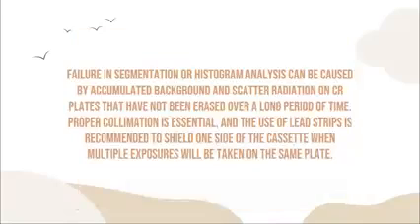Failure in segmentation or histogram analysis can be caused by accumulated background and scatter radiation on CR plates that have not been erased over a long period of time. Proper collimation is essential, and the use of lead strips is recommended to shield one side of the cassette when multiple exposures will be taken on the same plate. Okay, so what do you mean by segmentation? Sige, sa next slide na lang to siya.